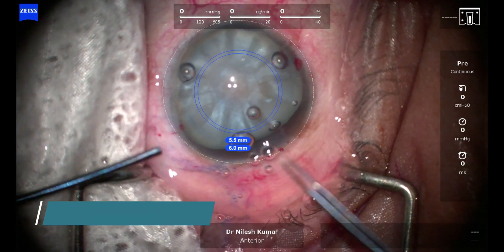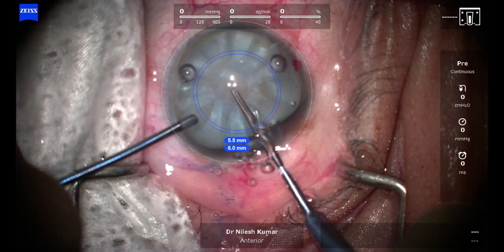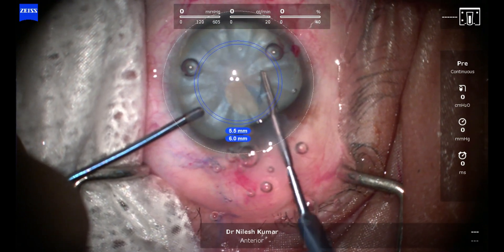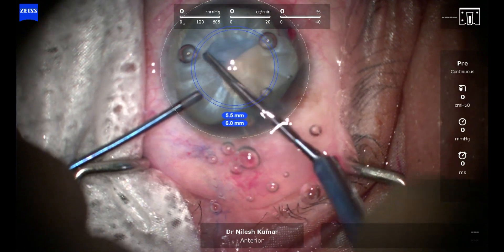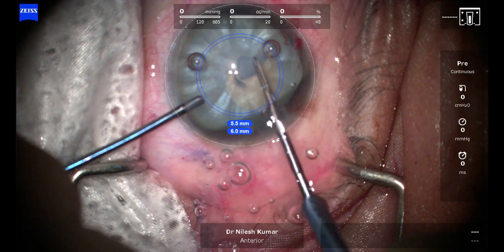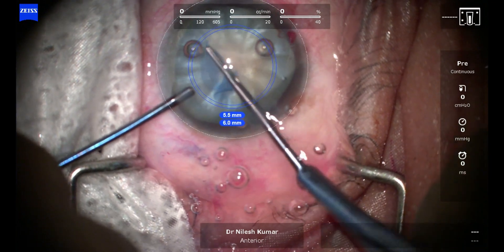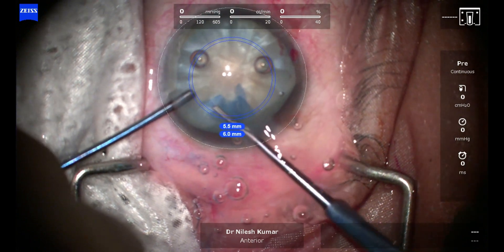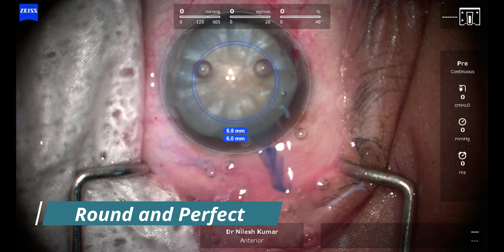So once we have massaged it thoroughly, we use the Haldipurkar forceps — an excellent micro rhexis forceps that goes in through the main wound and doesn't make the AC collapse because it is not pressing too much on the wound lip. We are now doing the capsulorrhexis. You can see it's a perfect 5.5mm rhexis; there is no chance of runoff.